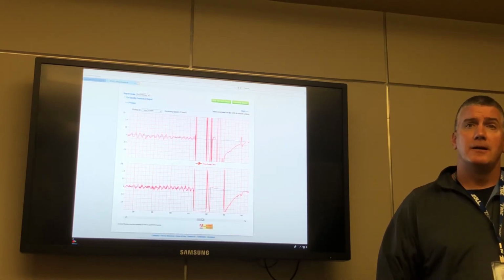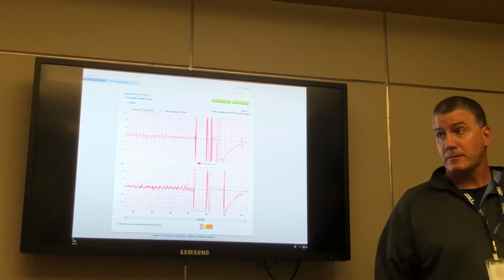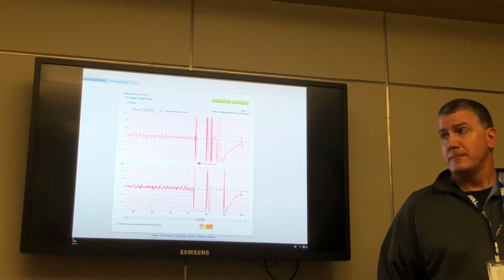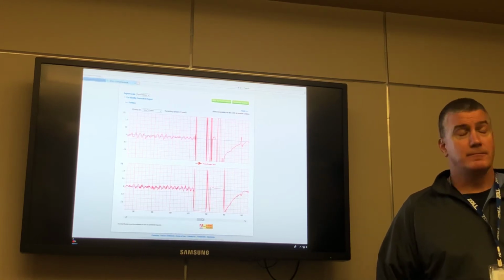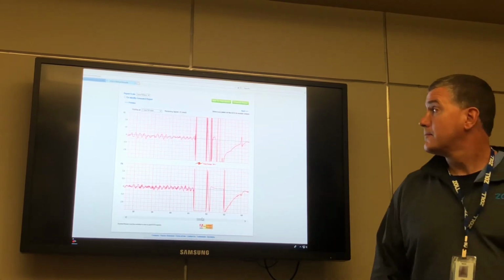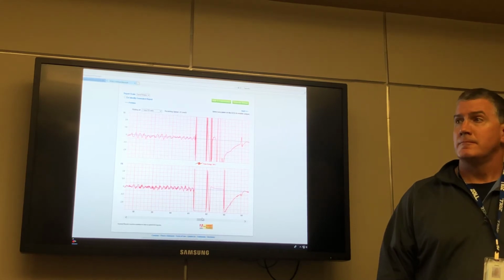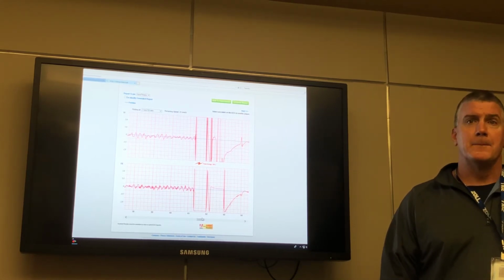And if you download this for us, or print it for us, or get a report for us, can we get it into their Epic chart? That would be your IT. Do you mean send it to you electronically into their chart? I know, only from being in the lab, that someone comes around, picks that up and scans it into their chart. It would have to be done that way, because it's a lot of paper.